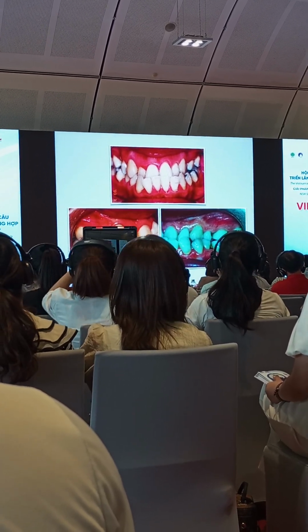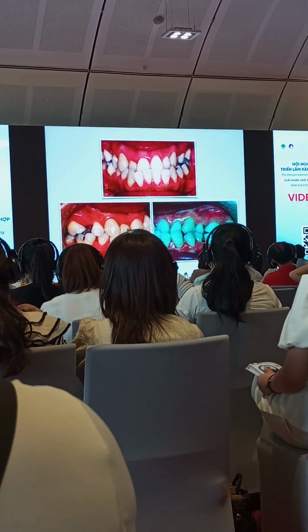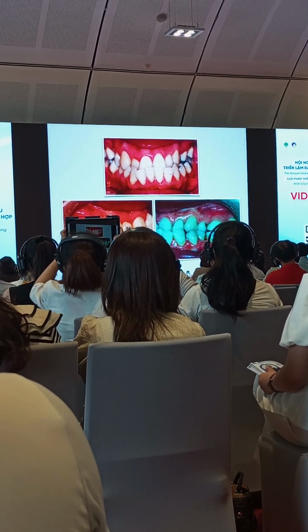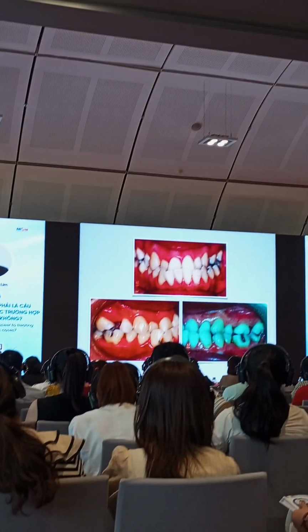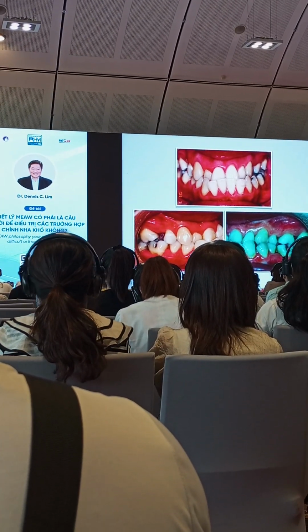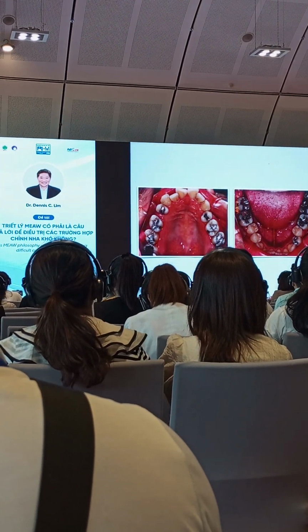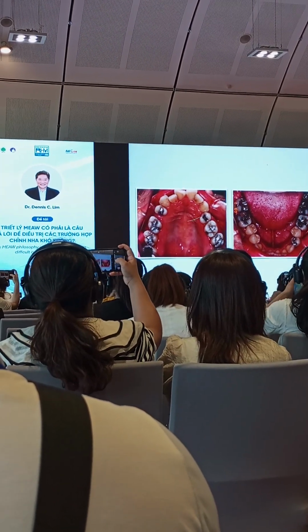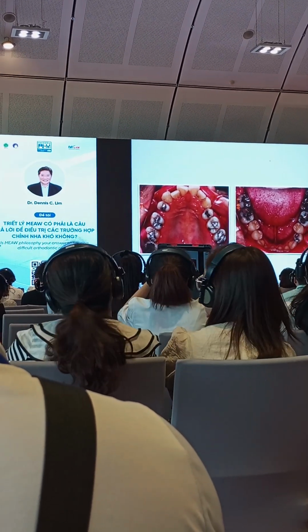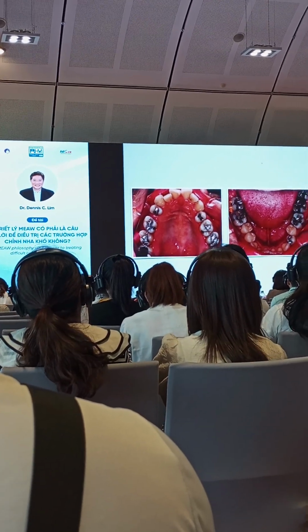She has missing premolars, which were previously extracted, maybe because of dental caries, not because of orthodontic treatment. Occlusal view, where you can see the crowding on the anterior region. She has all the way until the third molars. Third molars are present on the upper, and on the lower the third molar has also erupted.